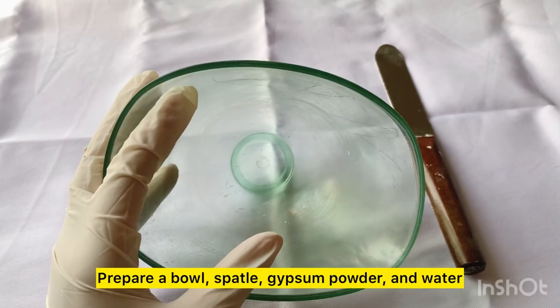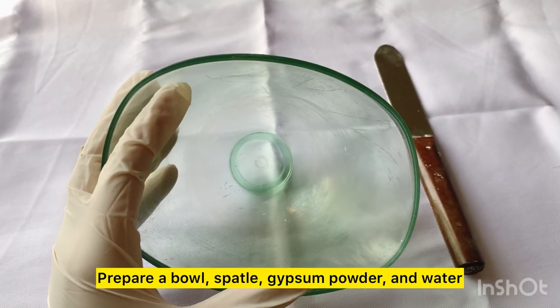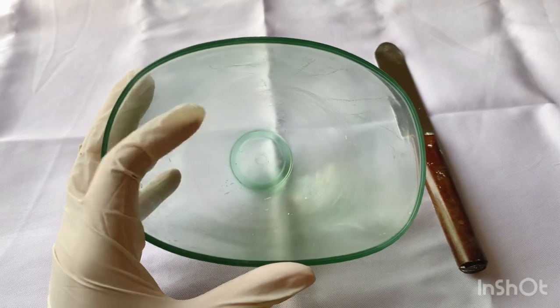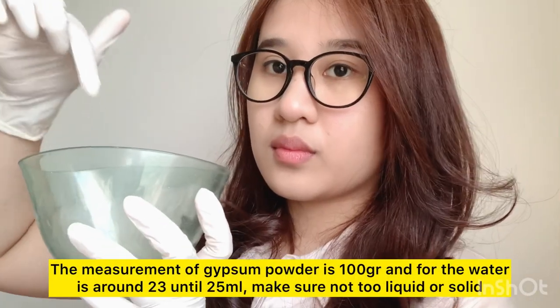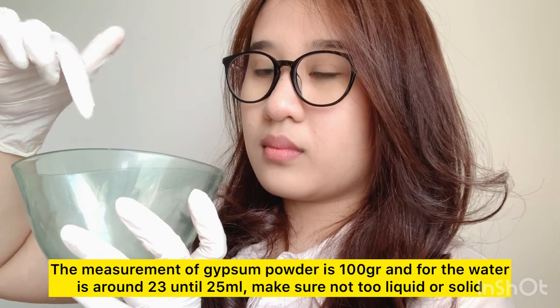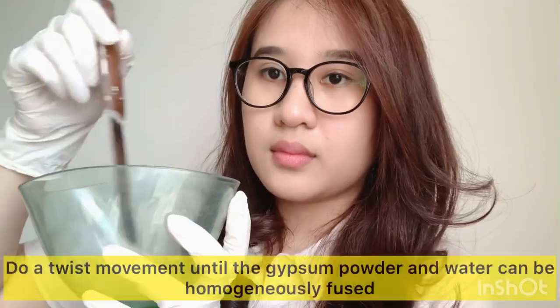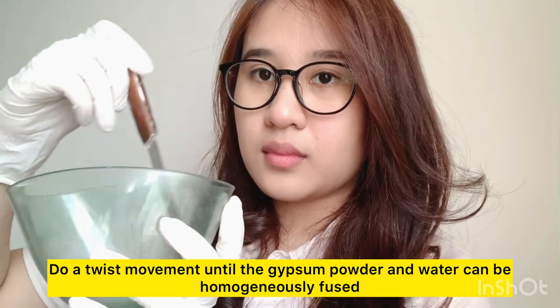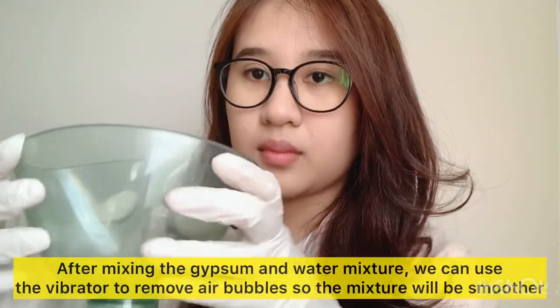And after that, we continue to make the base from the gypsum powder. Prepare a bowl, spatula, gypsum powder, and water. Put water first into the bowl, and then we can put the gypsum powder into the bowl. Do a twist movement so that the gypsum powder and water can be homogeneously fused.